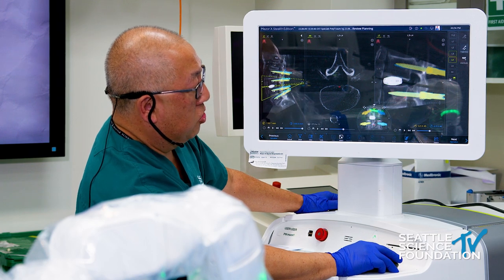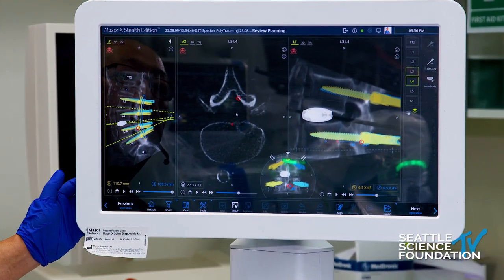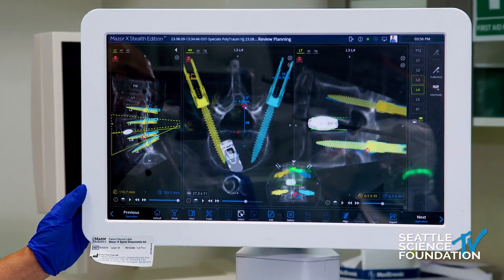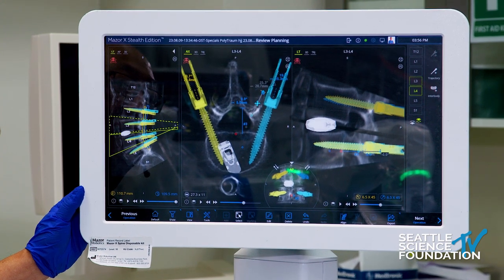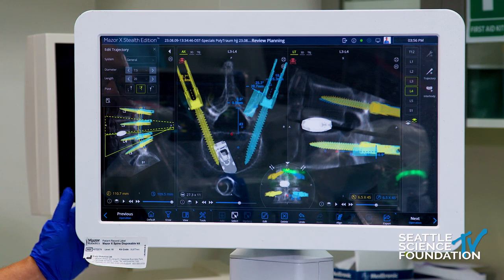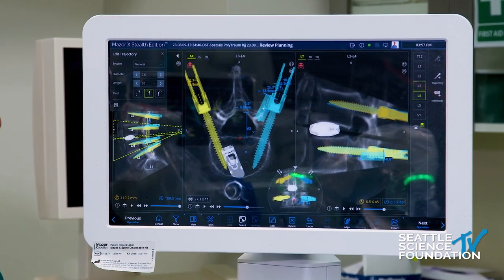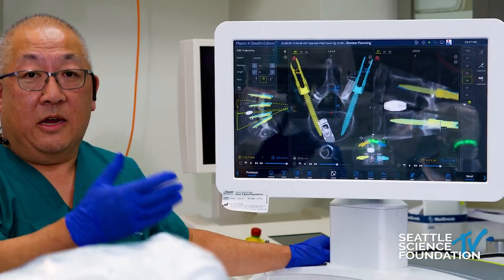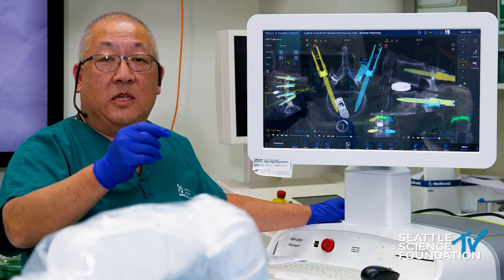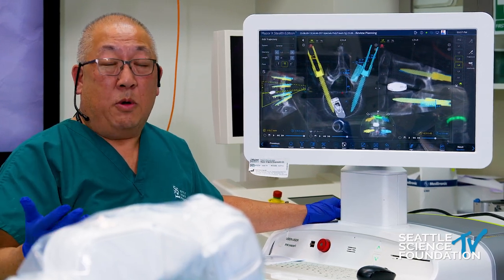I'm going to add what we call a trajectory. I'm going to take this trajectory and move it — pretend this is going to be a facet decortication tool. It'll look like a seven and a half millimeter tool, 20 millimeter length — like a tubular retractor. I save it and plant it right into that facet joint on the right side. That's now my trajectory that I'll send the robot to when I'm ready to do my facet fusion. We'll send the robot, make a small incision, drop a drill, decorticate the facet joint through that cannula, deliver two cc's of allograft or autograft into the facet joint, and within a couple of minutes do the posterolateral fusion.